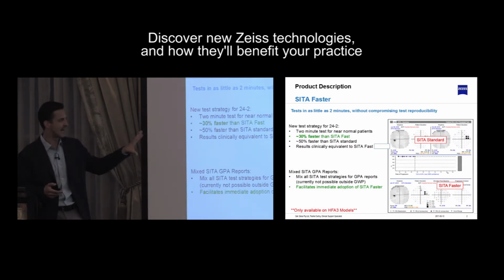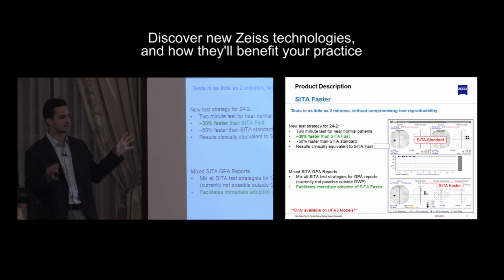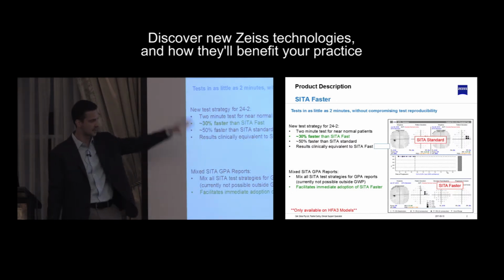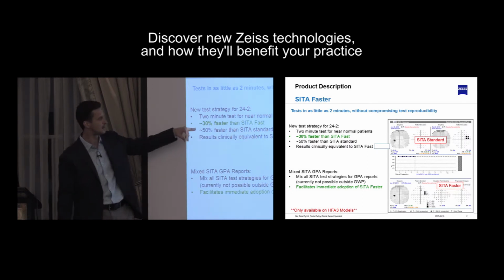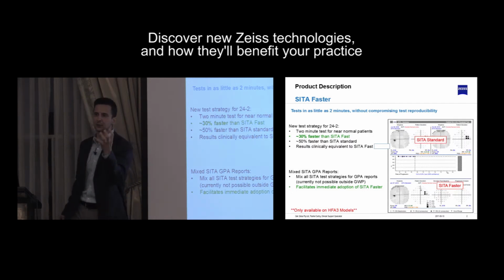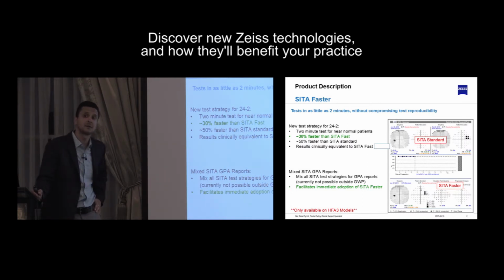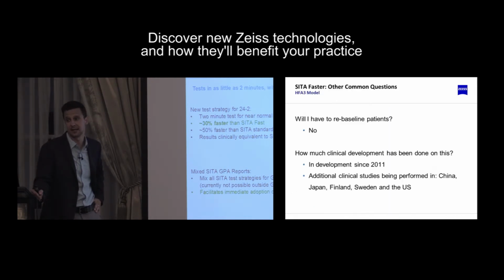A couple of quick stats about it, and this is really a very simple slide with a lot of information. You can ignore the information to the right, just to say they virtually look the same. They're equivalent. Sita fast and Sita faster were equivalent to each other in clinical evaluation. But the key piece are these two stats right here. You've got 30% quicker, that Sita faster is quicker than Sita fast by about 30%, and 50% quicker than a traditional Sita algorithm.